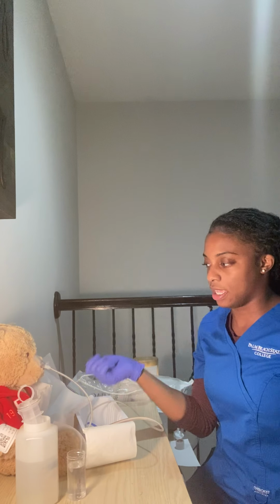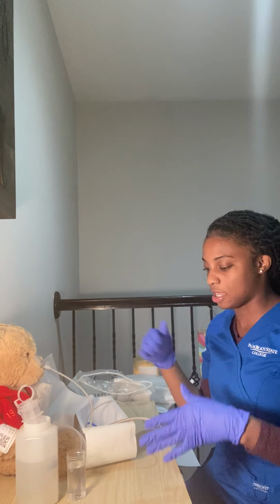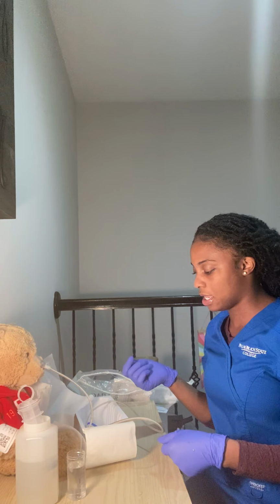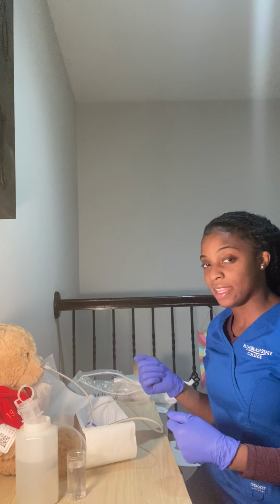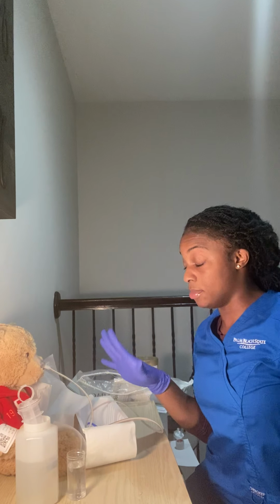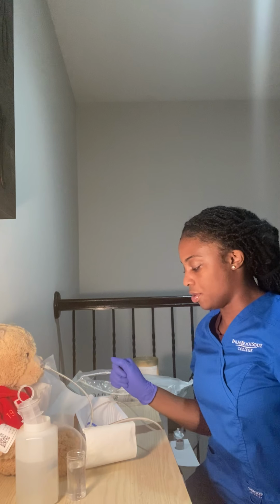While I was inserting the catheter, my patient was taking his big gulps. I wasn't able to simultaneously say both, but he was taking his big gulps as I was inserting the catheter. And that's it for my NG tube. And after I did my abdominal assessment again, I'm gonna connect it to my wall suction. And now I'm done with my NG tube.